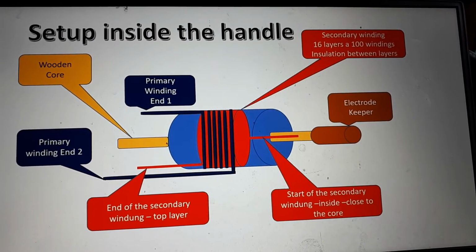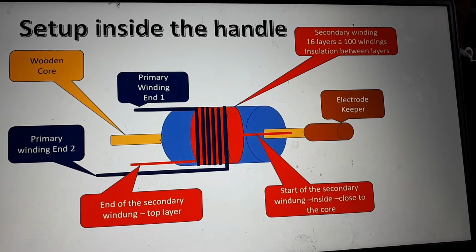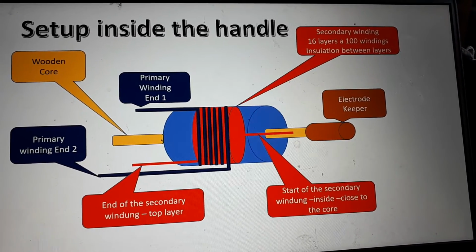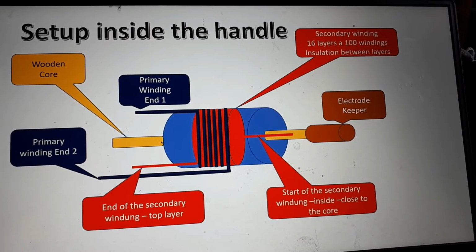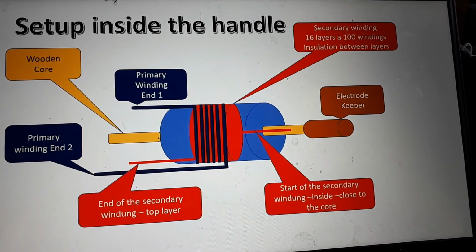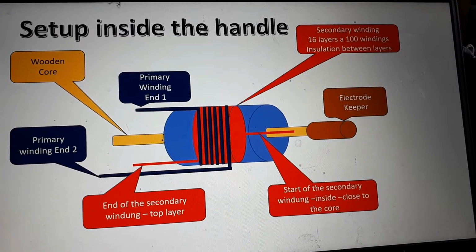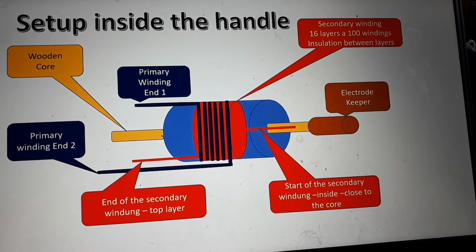For checking the secondary winding, this is a little bit more difficult. Normally you find, under the first layer of the paper, the end of the secondary winding, which is a very, very thin cable. And this is the first point where you start your measuring. The secondary winding has another end which is somehow connected to the electrode keeper.